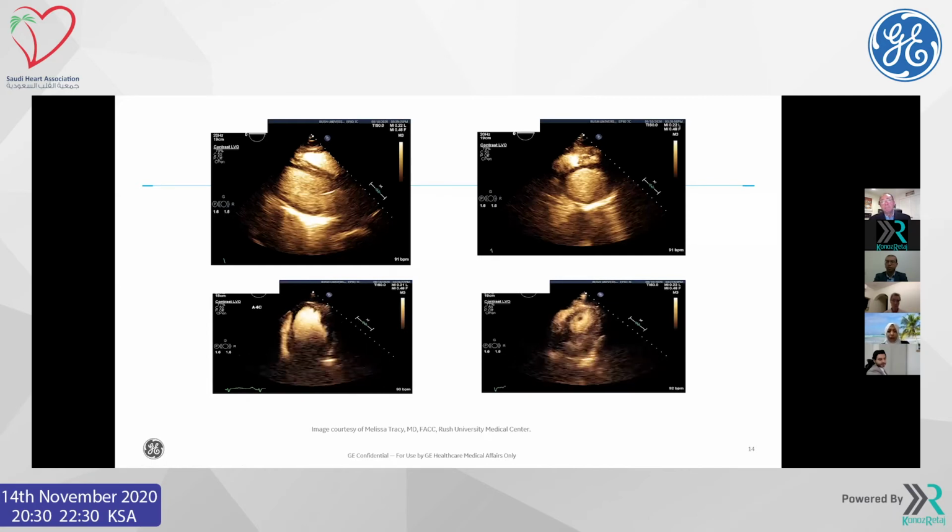If we go a little bit down, we will have a clearer picture showing the endocardium and epicardium together with the whole apical segment. And sometimes this will show you more hidden pathology like a thrombus, which is laminated in that area. Do you agree with this?